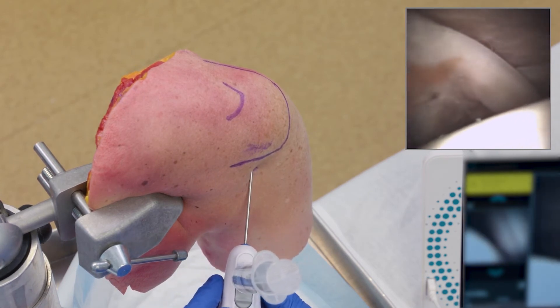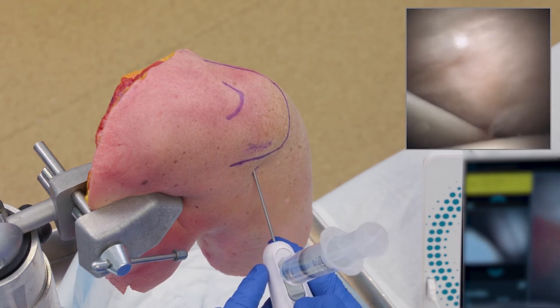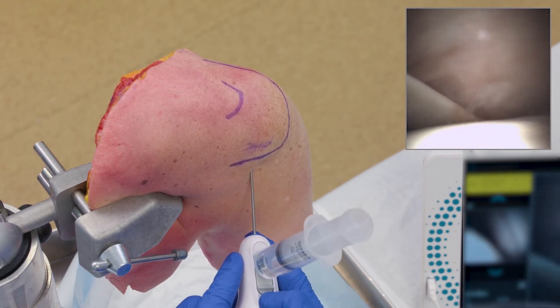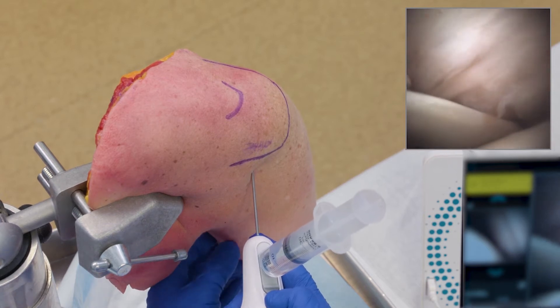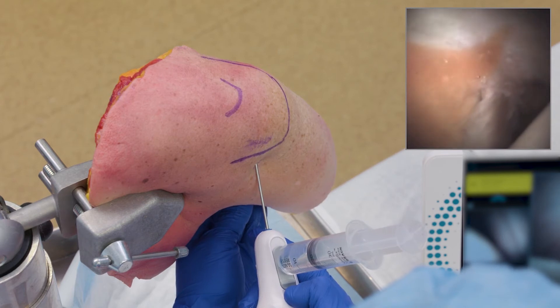From here I can push forward and watch my biceps come across over top of the humeral head and attach to my glenoid. That's a really good look at my biceps hiatus, and I can forward flex the arm to see where that biceps escapes down the sheath.